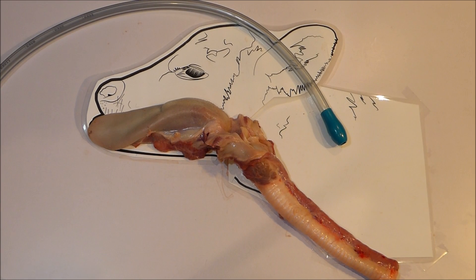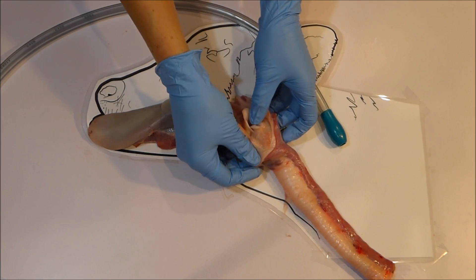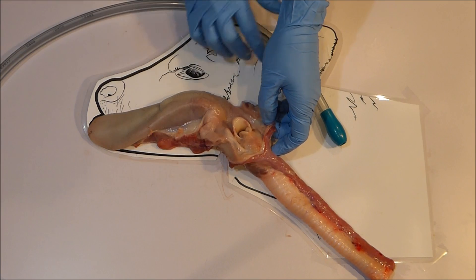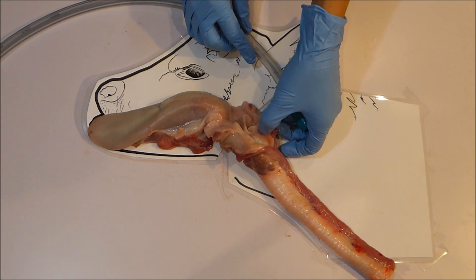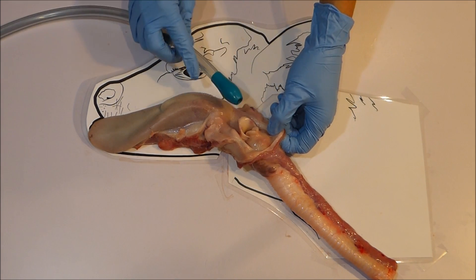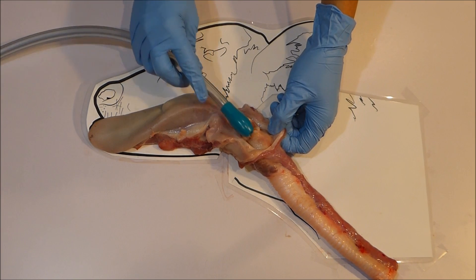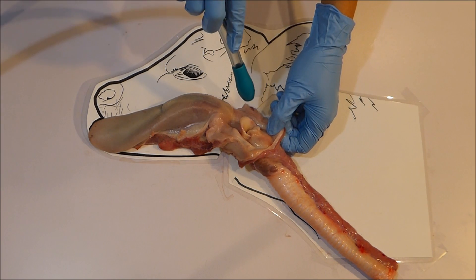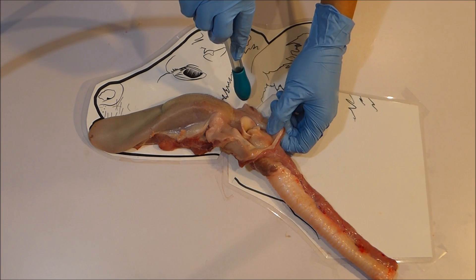Which side do I pass the tube is a common question. Gentle handling and gently passing the tube, leaving the placement up to the calf, is the most important tip. But to answer the question, if you were going to favour a side of the mouth to pass the tube down it would be the calf's left side. As already mentioned the esophagus sits ever so slightly to the left, so the left side is considered the better side to pass the tube. The airway entrance is in the middle, so if you pass the tube to one side it helps the tube avoid the centre and therefore the airway entrance. You shouldn't be creating a forced downward angle where pushing into the airway entrance would be an issue.